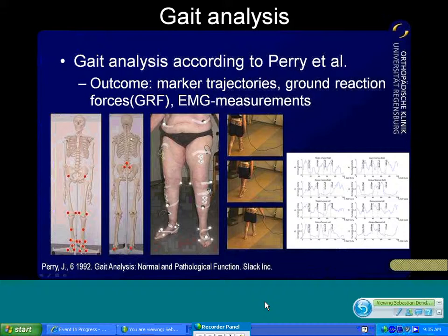In this picture you can see a fully prepared patient right before the gait analysis. And as you can see, we used an EMG Biovision system to measure different EMG muscles such as the gluteus maximus, the rectus femoris, the tibialis anterior, and the gastrocnemius lateralis.